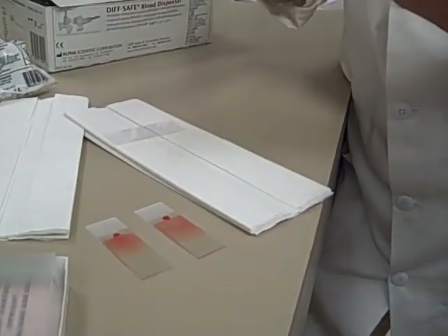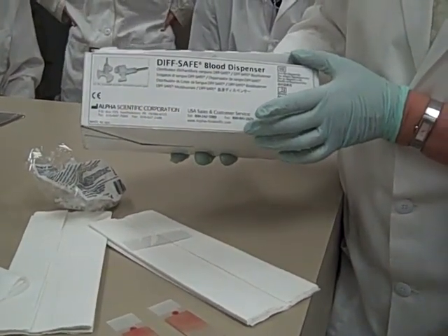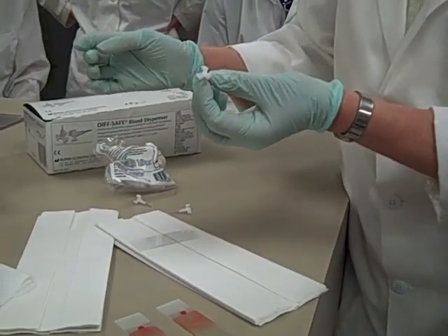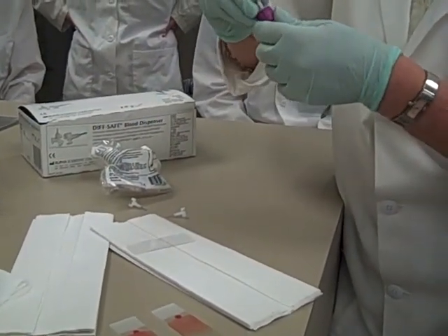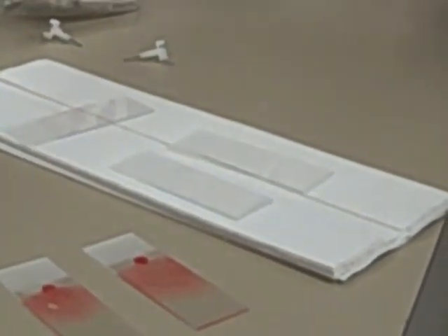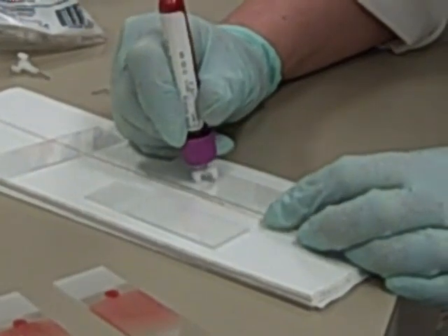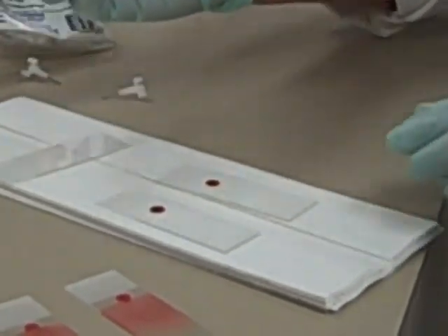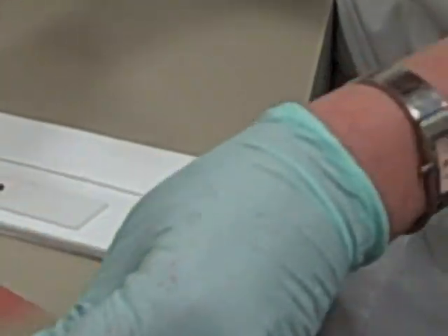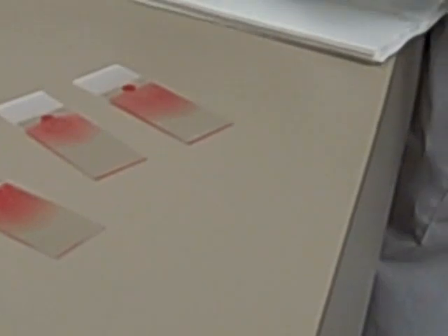This is the way I want you to do it in class: we're going to use a Diff Safe Blood Dispenser. This way you're not taking the top off the tube. These just look like a little helicopter — that's what I call them. You just pierce the cap with your helicopter. When you turn it over, it's not going to dribble; you need to apply pressure for the blood to come out. The more pressure, the bigger the drop of blood. So just a little drop of blood.